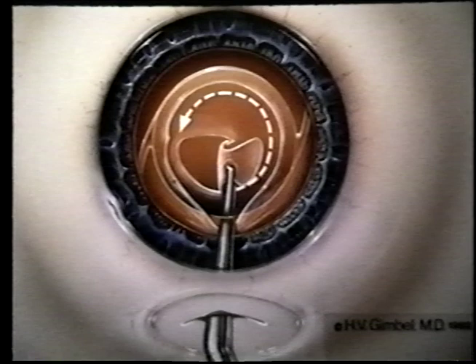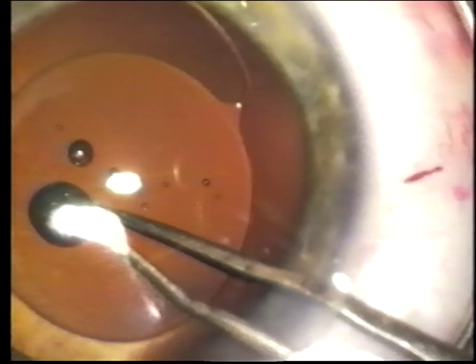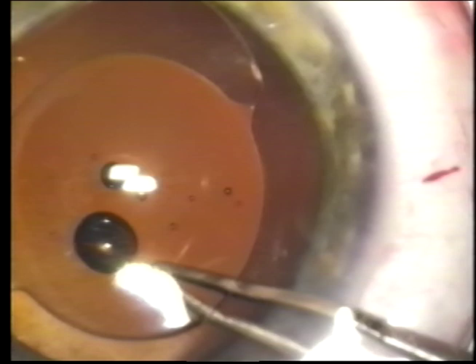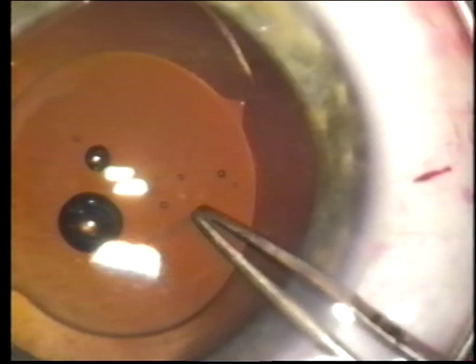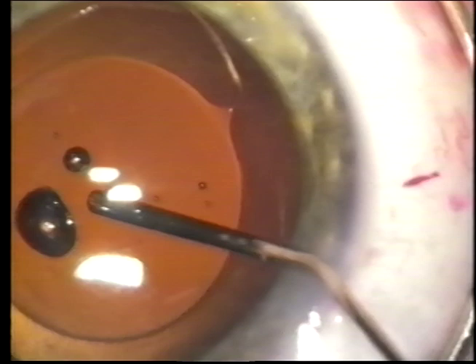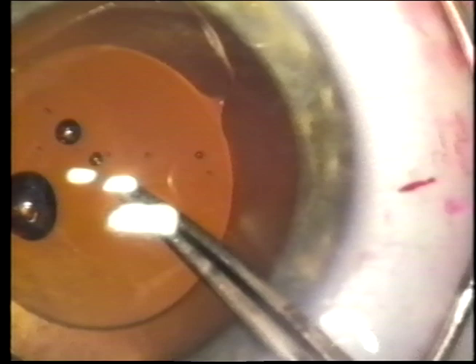Sometimes the light reflex can be in the way and the eye may have to be turned to one side or the other. Then the tear is extended until the flap can be grasped with the forceps and, as with anterior capsulorexis, vector forces are applied to create a tear of the proper diameter and concentric with the optic of the IOL. The posterior capsule is thinner and it rolls up and may be difficult to re-grasp, particularly if the viscoelastic pushes the capsule flap backwards.